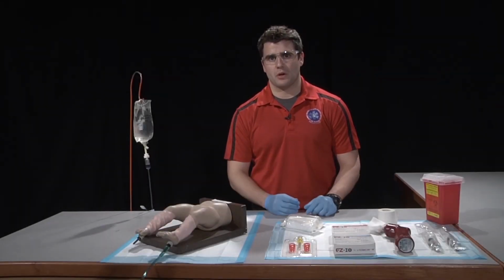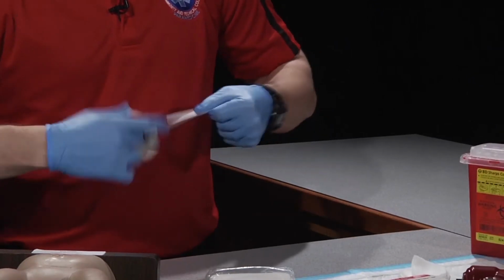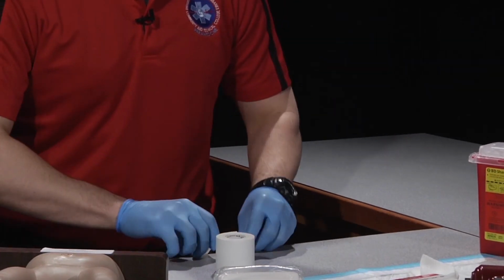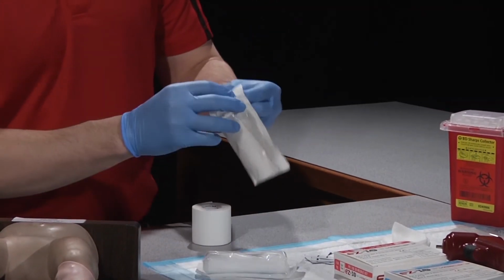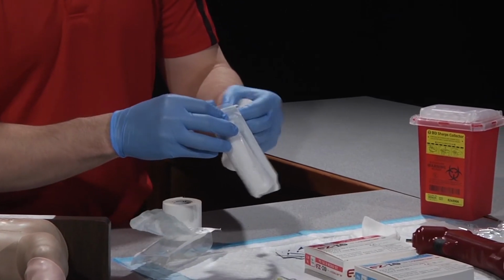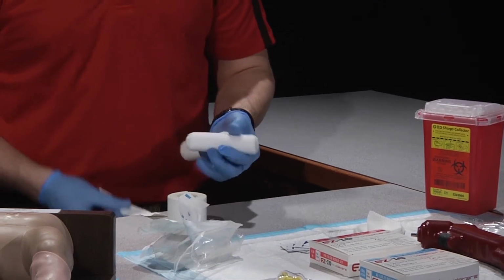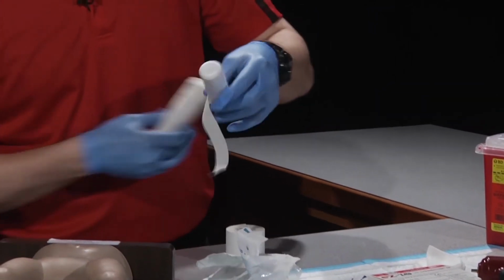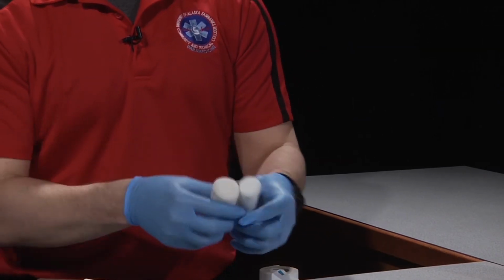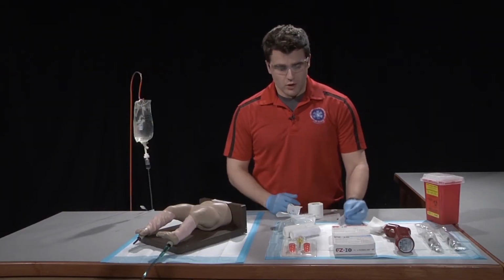Now we're going to prep the rest of our equipment for the IO puncture. First, we're going to prep the tape and our securing device. We're going to remove the Curlex from its packaging and tape one side of each end together. From there, we're going to make sure we have our alcohol swabs, and we're going to make sure we have our appropriate PPE.